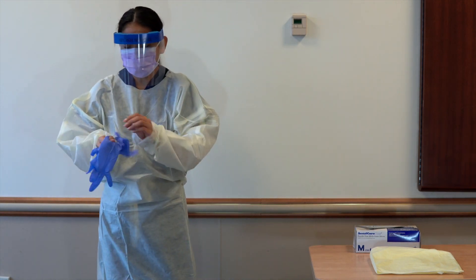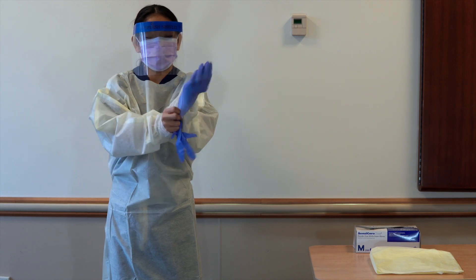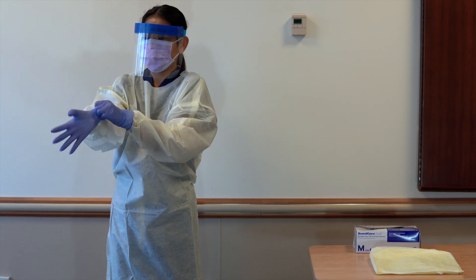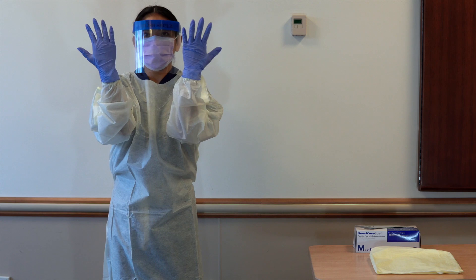Don gloves. Extend to cover wrist of isolation gown. If extended use of PPE is being practiced, follow the guidance on the extended use of PPE as outlined on the internet.